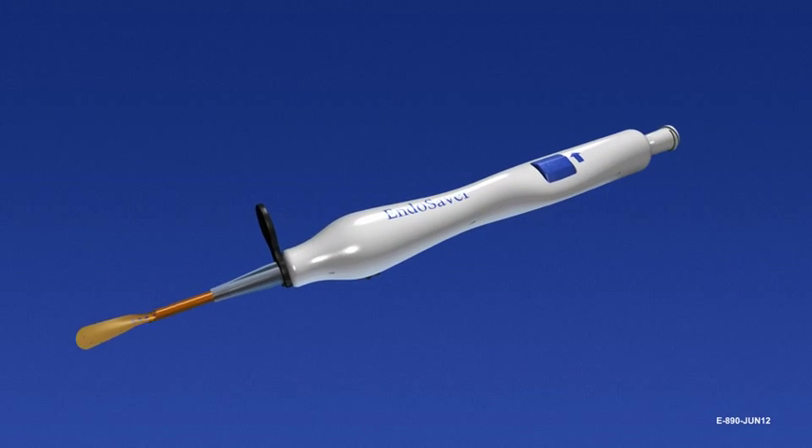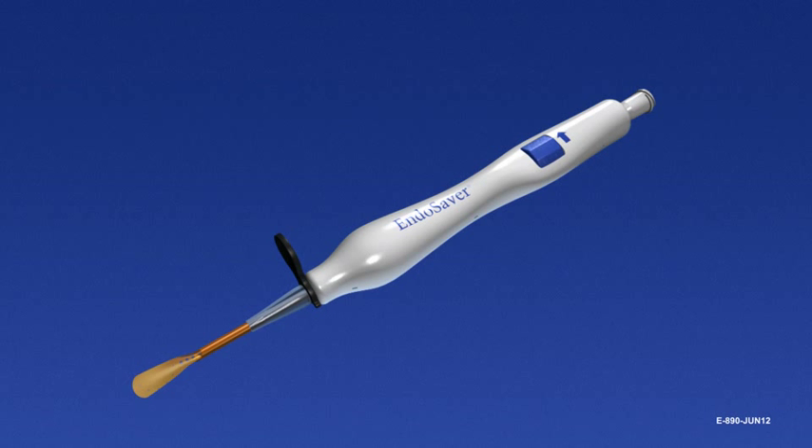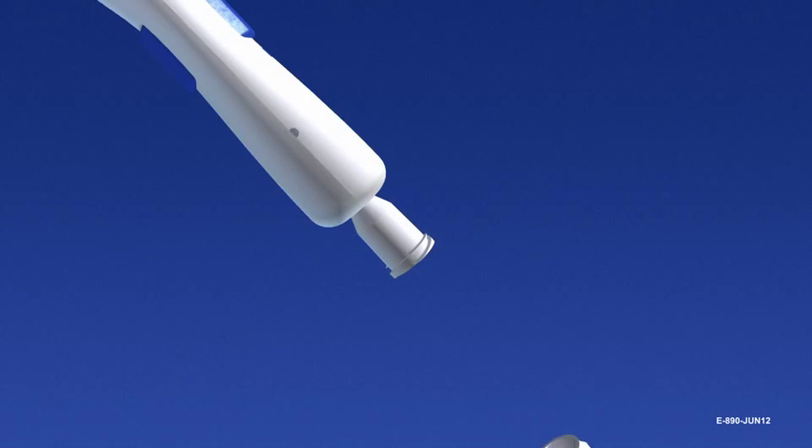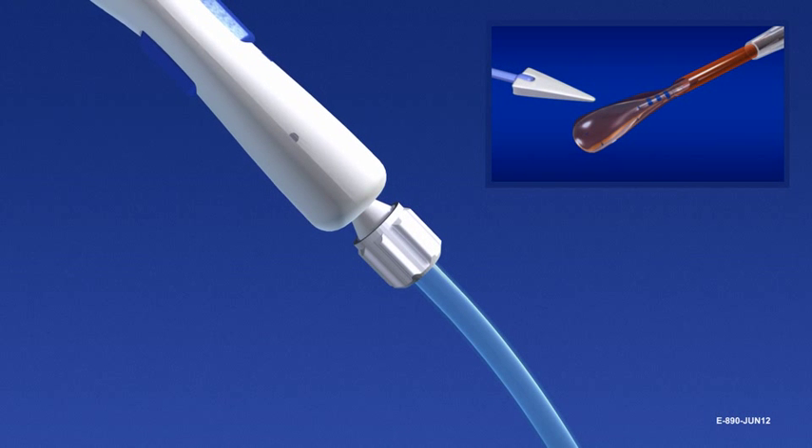Hold the device so the side printed with EndoSaver faces up. The device must be flushed with balanced salt solution prior to loading. Lower the bottle height to 40 centimeters. Connect irrigation tubing to the lure connection and flush with balanced salt solution. Remove excess moisture from the carrier with an absorbent sponge.